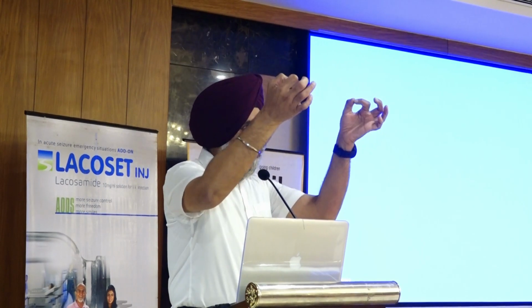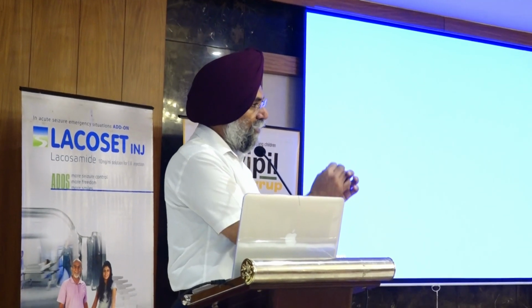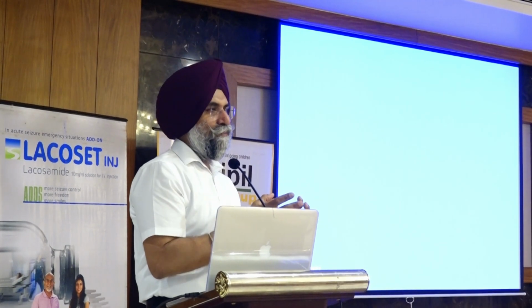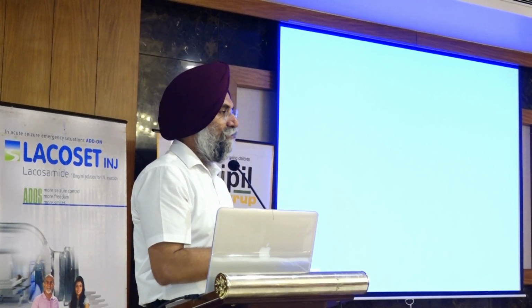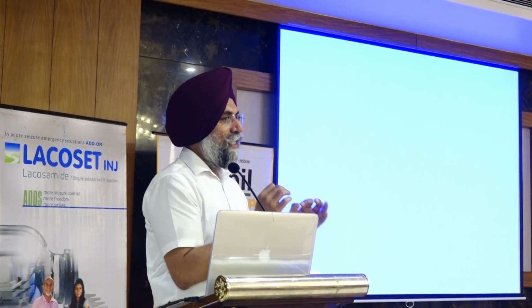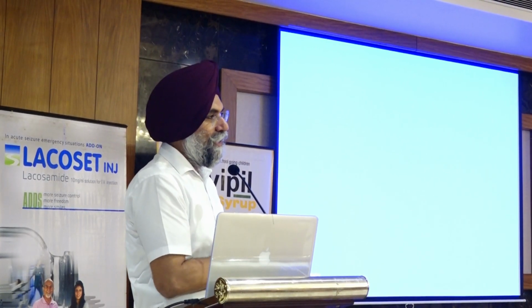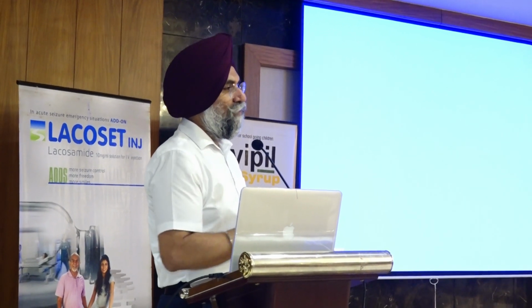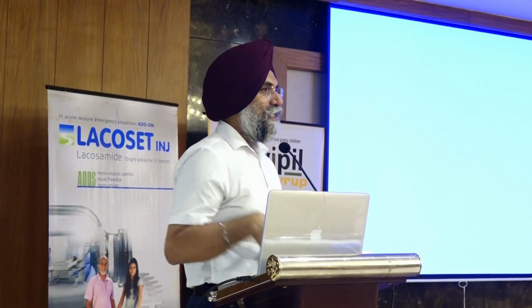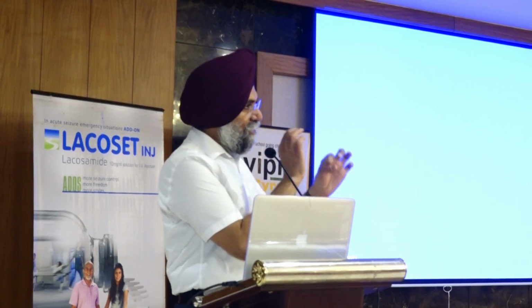The collimator has the holes through which the radiation comes and forms a sphere of radiation at one typical point. Many of you might not have seen how the gamma knife functions. Gamma knife basically has multiple sources, 192 sources in the model we are currently using. The previous models, model B and model U, used to have 201 sources. The current model has 192 cobalt 60 radioactive sources. They are all positioned in such a way that all 192 beams focus at one single point.